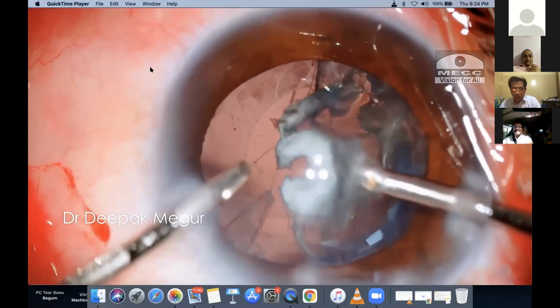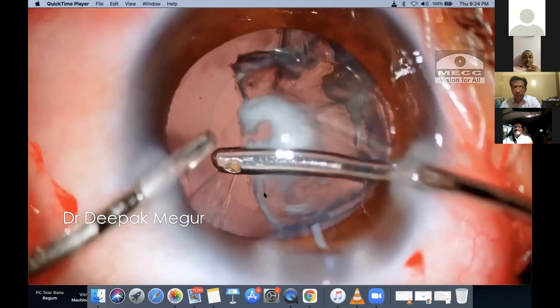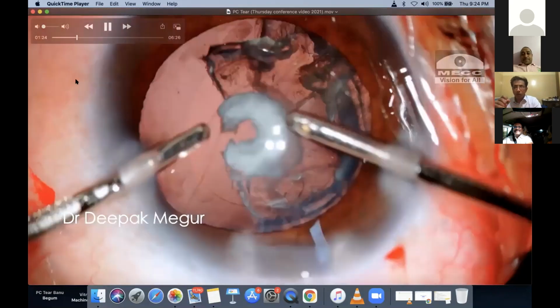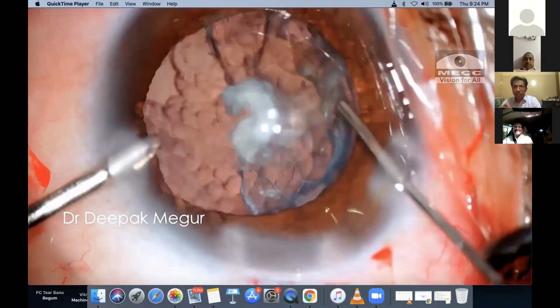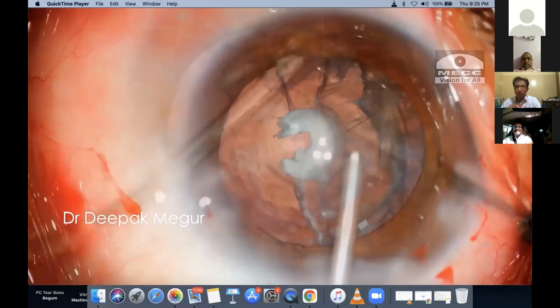And you can see now it is clear that a vertical through and through split is seen in the posterior capsule, extending from this end to that end. So before removing, again, we don't want the chamber to collapse. So I'm using viscoelastic agent to form the chamber a little bit. Again, inject just a little bit. You don't want it to be too much here. And then again, switch hands and complete it.